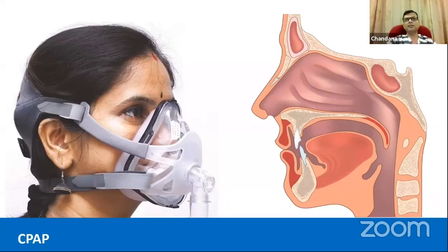Initially, what they wanted was some kind of positive pressure developed in the throat so that when they are in deep sleep, the throat won't collapse and obstruct the airway. That was called CPAP, a continuous positive airway pressure, so that the patient can still breathe and has some way of exhalation, but at the same time you maintain a certain positive pressure in their throat. That was the idea of having a CPAP.